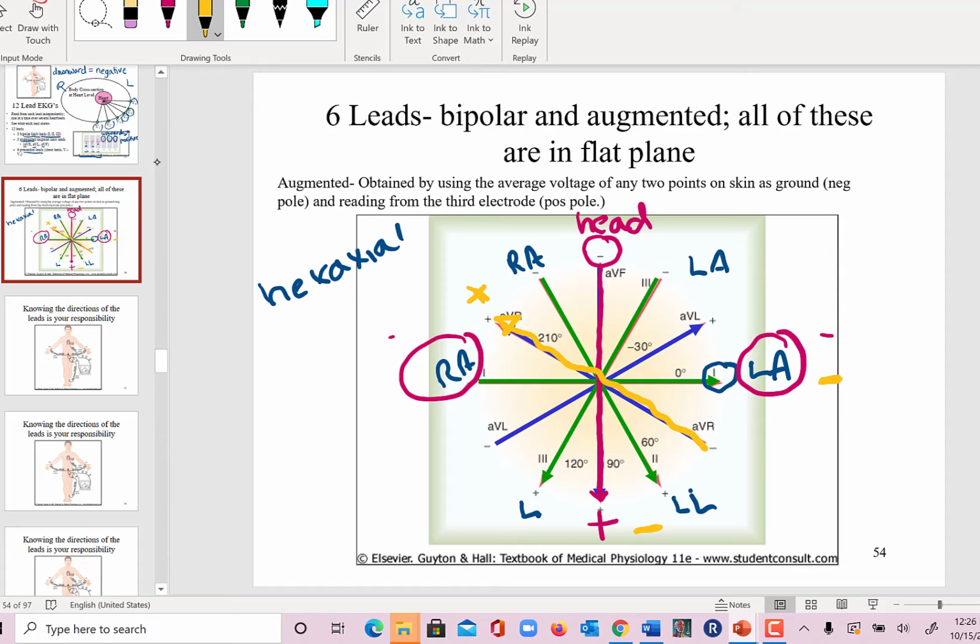And so the average distance between your feet and your left arm is somewhere in between your left foot and your left arm, if your left arm was being held out like you were being crucified on a cross, okay? And then that average pole here in space that I'm circling with the positive pole pointing over your right shoulder. I think you're getting the idea.